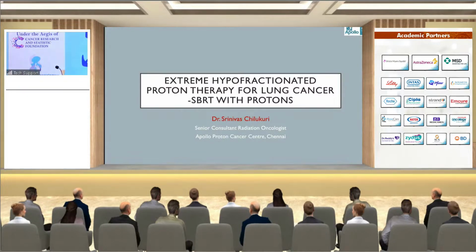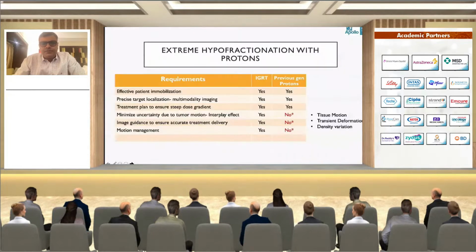Of course, I think I have been given a very challenging topic because proton therapy is not very well established in this context of stereotactic body radiation therapy. And I will try to do justice to this topic as much as possible. The reason why it is not established is because of inherent limitations of the proton therapy technology available so far.